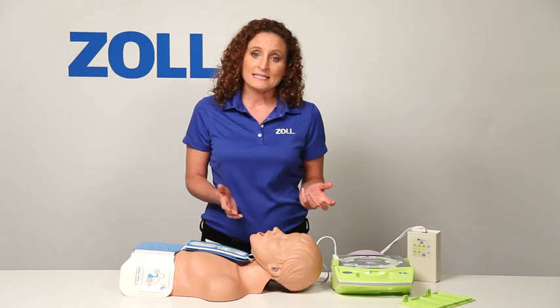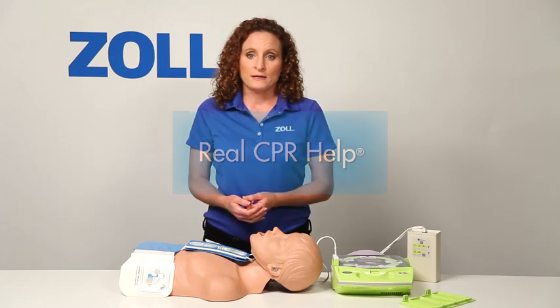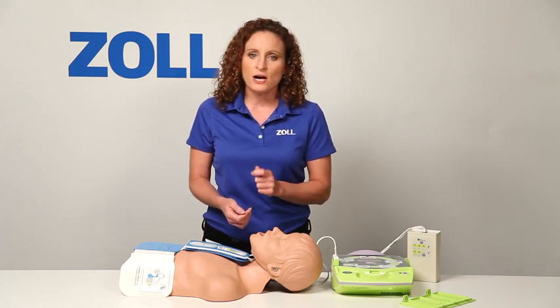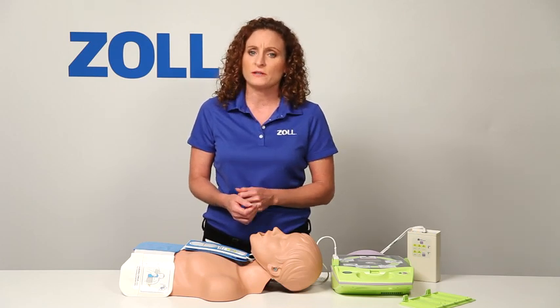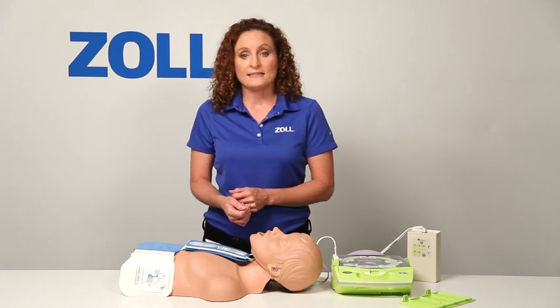As you can see, purchasing the AED Plus gives you Real CPR Help, the lowest total cost of ownership, and it helps in every rescue — not just half the time when a shock is advised. Your rescuers deserve all the support they can get in every rescue, and that's why they need the AED Plus.